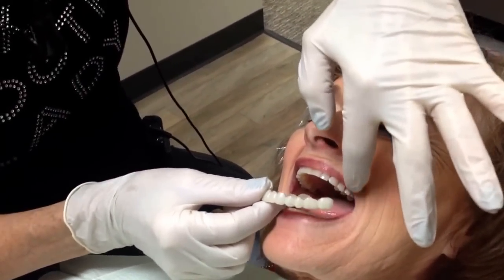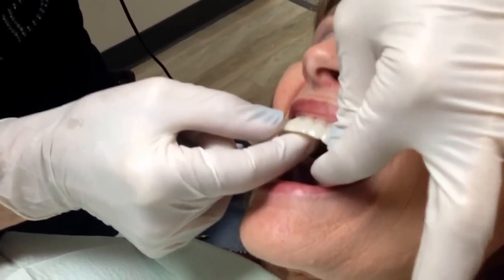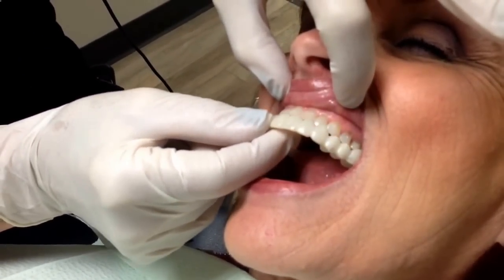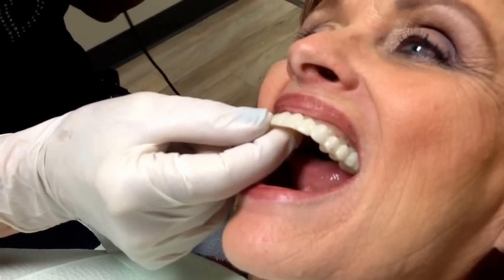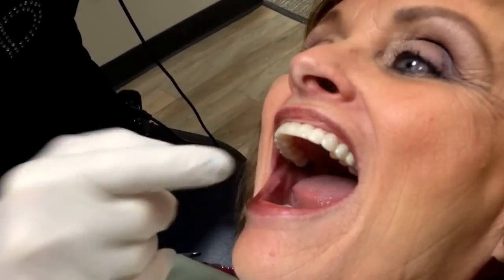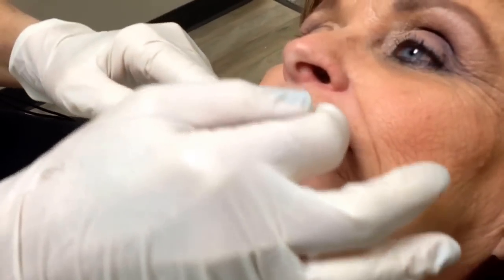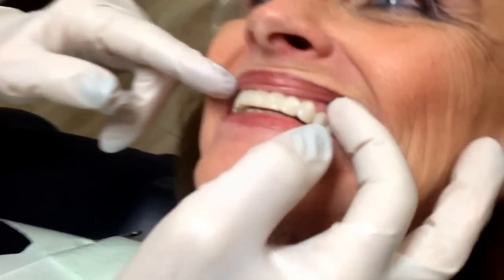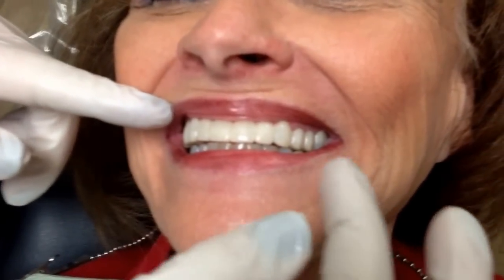All right, now it's going to snap in because it's the Snap-on Smile. As you can see, just a little bit of a color change — it's a little bit lighter. We don't want to go too light, and it snaps in. Bite down for me. Smile. And as you can see, she now has teeth that are not all the same length — much prettier smile.